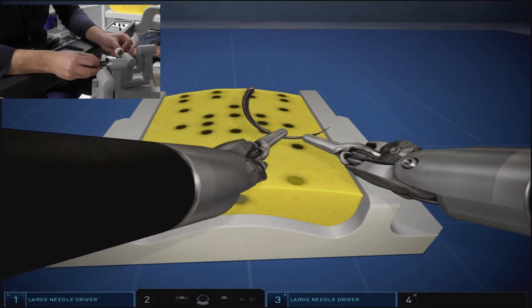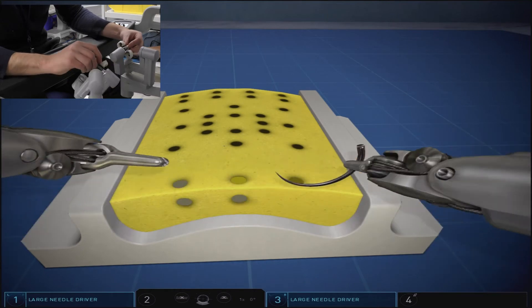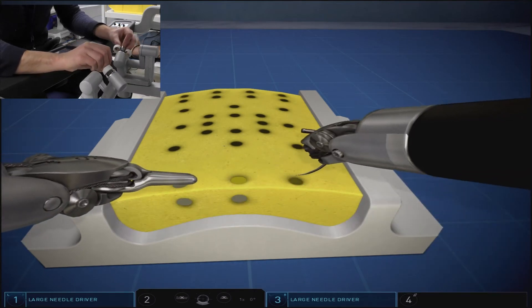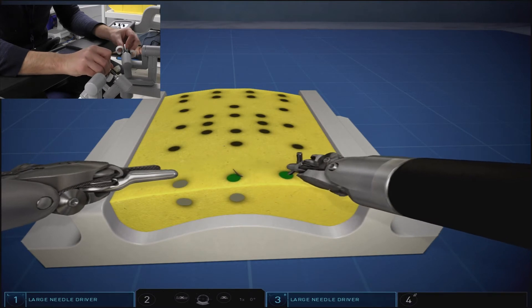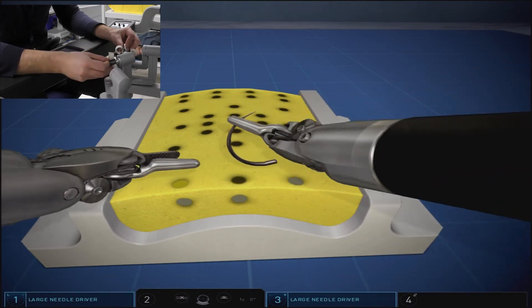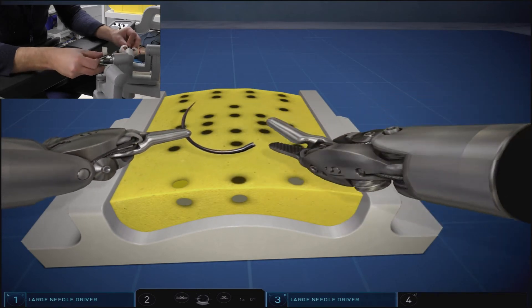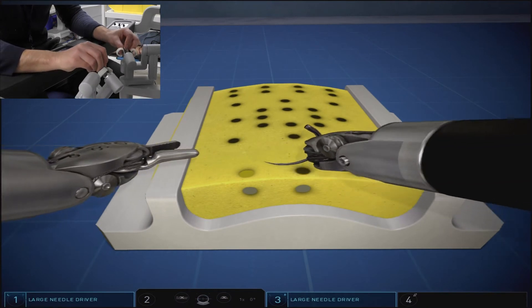You can see that we completed our first successful run through the Big Dipper Constellation, and now we are going back. The purpose of this is to provide practice with needle handling and force you to anticipate what the next throw will be, so that your pull-through and reload are efficient and purposeful in order to set you up for the subsequent throw.